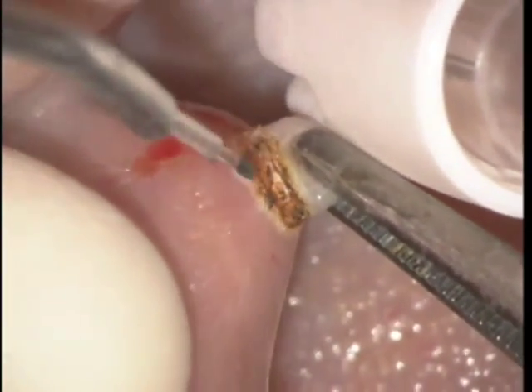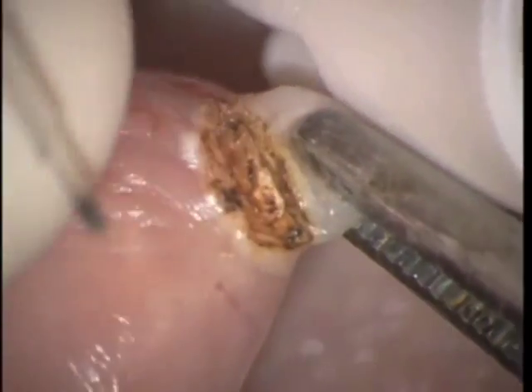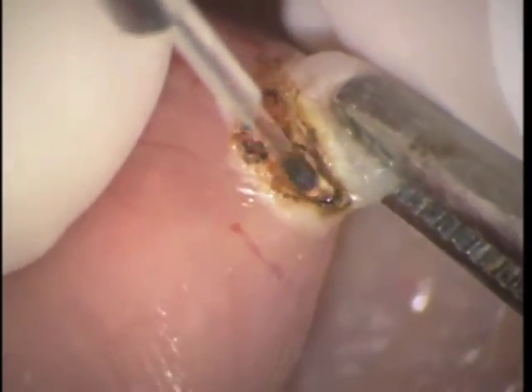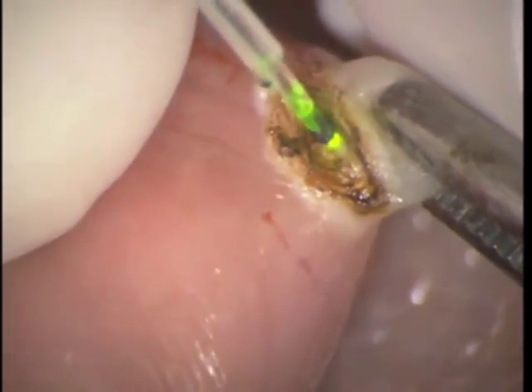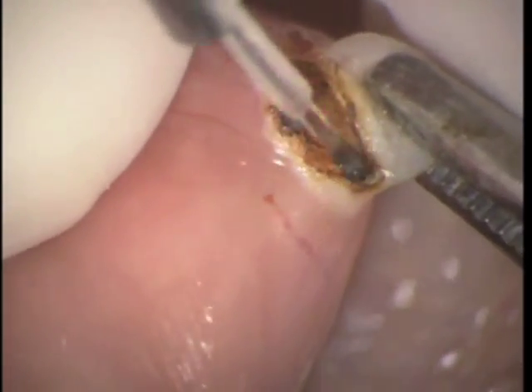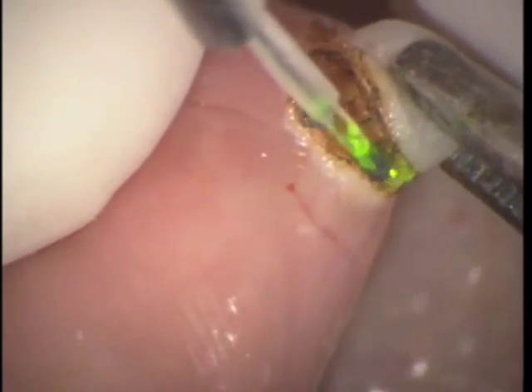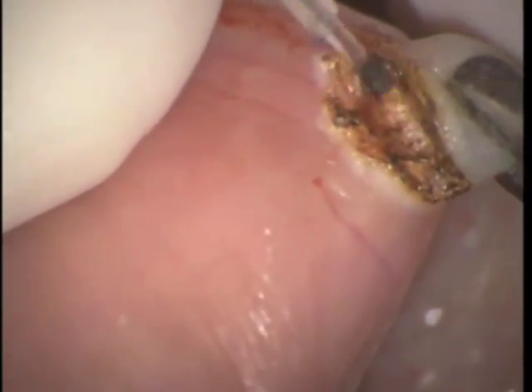If you want to up the energy you can do so, but if you were to use higher energy, the fear is that you may really cook the tissue and when you send it in for biopsy it's difficult for the pathologist to read. You're using small brush-like strokes and evaluating the tissue-laser interaction to make sure you don't get a lot of charring. You can see here that the tip of the AMD Picasso laser is initiated on carbon paper to give a black hot tip.